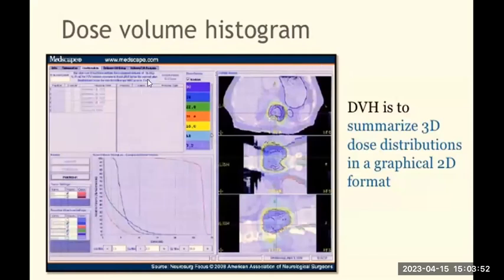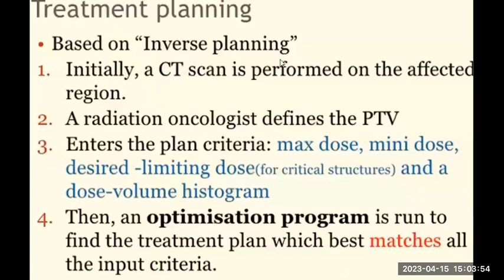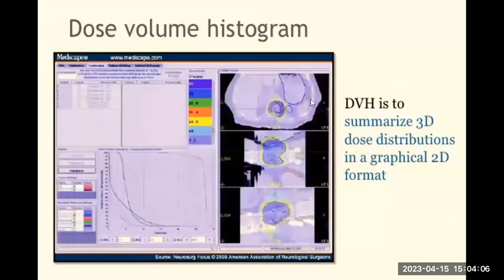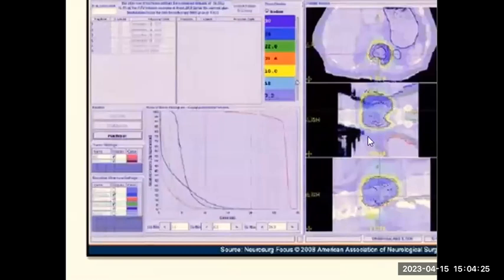So the first step, the CT scan is performed and the 3D is obtained. From the 3D, once the dose level is confirmed, you get the dose distribution graph. In the three images in the right corner, you can see how the tumor is marked with a yellow marking around it. You can see the tumor shapes are very irregular.